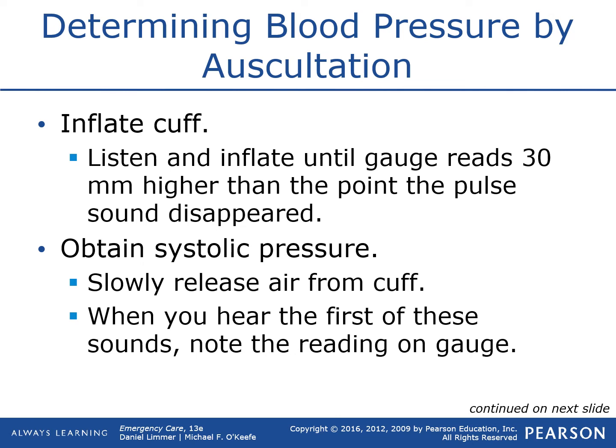Once you hear it, so you know you're in the right position and you know what it sounds like, go ahead and inflate it above where you should lose hearing of the blood pressure. So usually around 150, 160. That's usually where we are going to have a good solid loss of our sound for a while. The textbook says to go about 30 millimeters higher than when you lose the sound. So try 150, 160. If you still hear it, keep on pumping up until you can't hear it anymore.